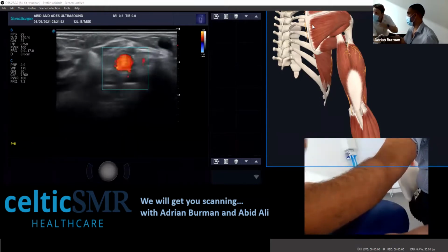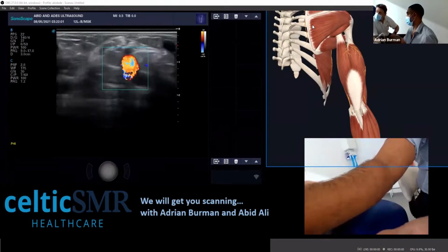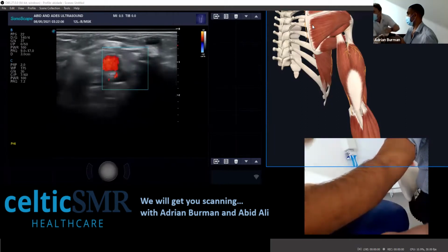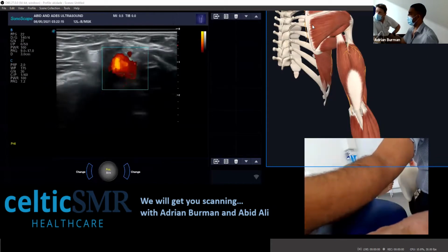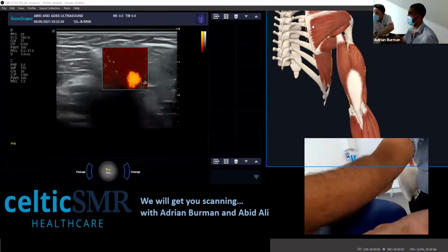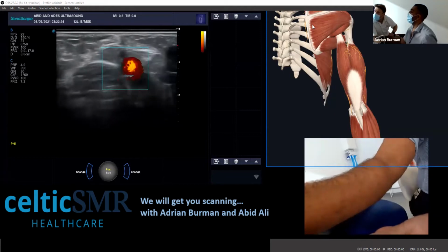So you're always going to use CFM just to look at blood flow? Yes, you can do if you want to know what direction it's going. So this colour flow is for direction. If you're not bothered about direction, then obviously PDI, which is the power doppler, will just give you flow. So that's independent of direction. Okay, so it's orange no matter where you angle. Okay, so that's probably a little bit overpowered, so we can probably take the scale up a bit. It'll just crisp that off a little bit.